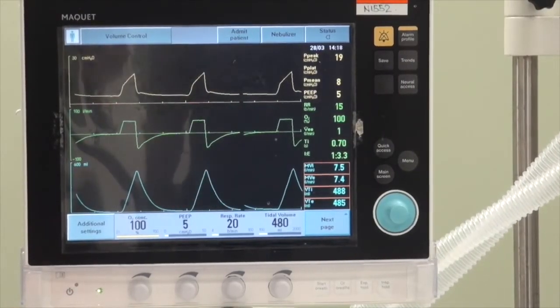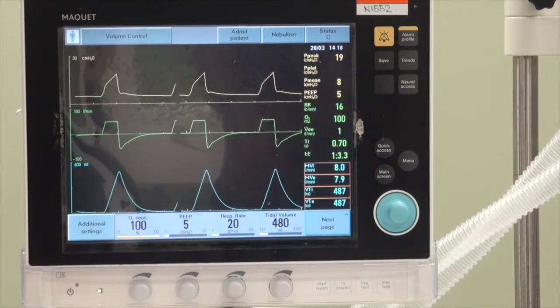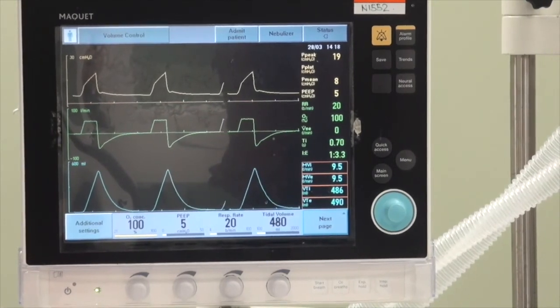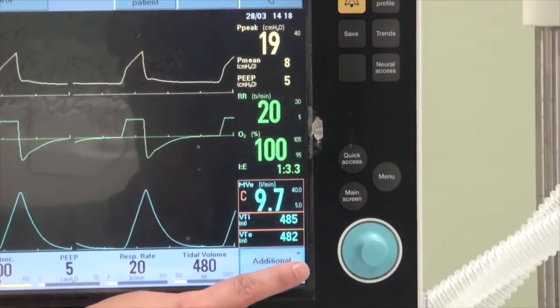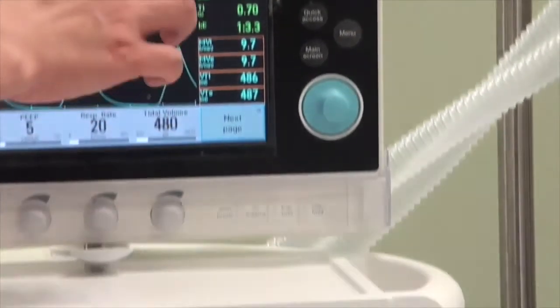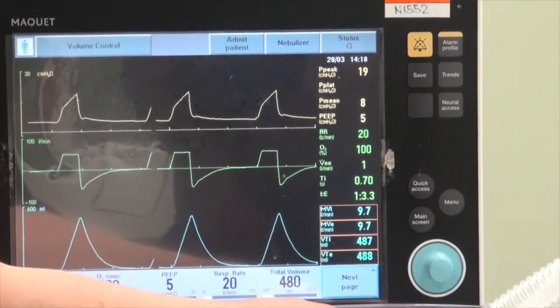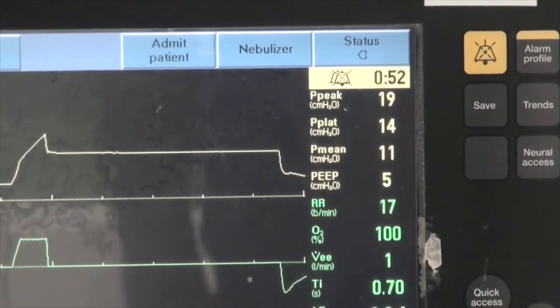We will now demonstrate respiratory maneuvers to better understand the patient's lung mechanics. The two common maneuvers are an inspiratory hold to measure plateau pressure and an expiratory hold to measure total PEEP. To activate the inspiratory hold, go to the parameter screen that reflects plateau pressure, then press the inspiratory hold button at the bottom right-hand corner. The ventilator will induce the inspiratory hold and the plateau pressure will be reflected on the screen.